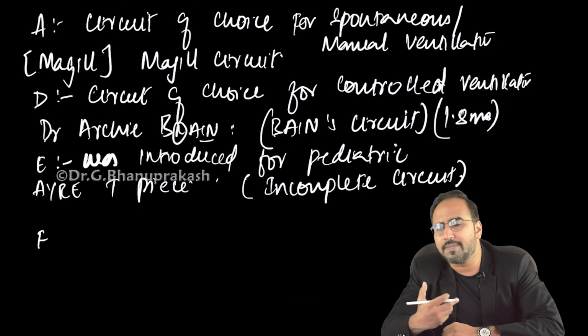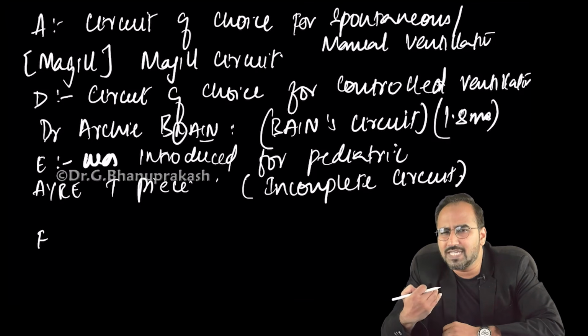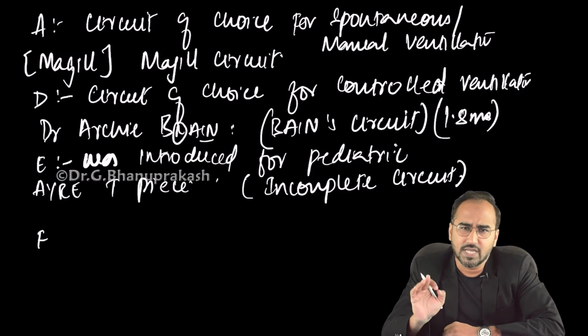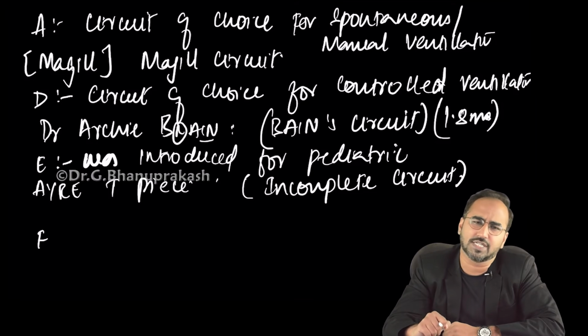When a patient is kept on ventilator, we have to take a decision when to remove the ventilator from the patient. When a patient is improving in health, we remove the ventilator. Yes or no? For weaning the patient from ventilator, first we give a trial of T-piece. The T-piece is the Mapleson E circuit, where we give oxygen through this circuit to the patient with a very low flow, and we assess whether he is maintaining saturation or not.